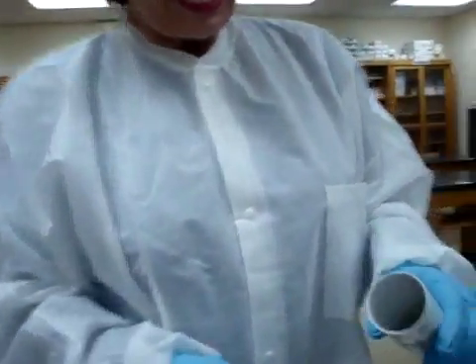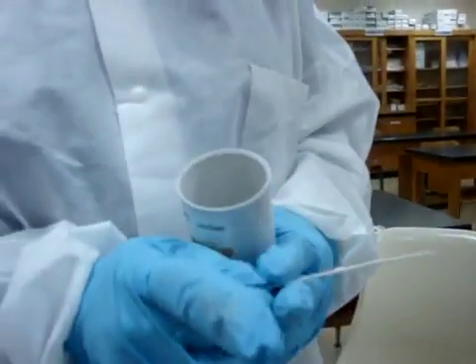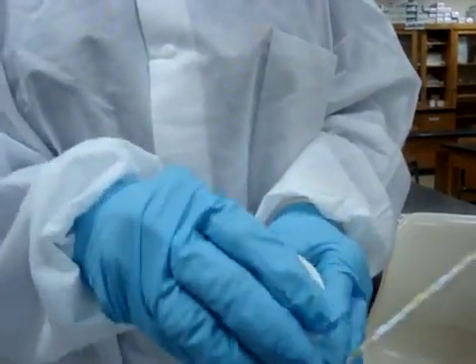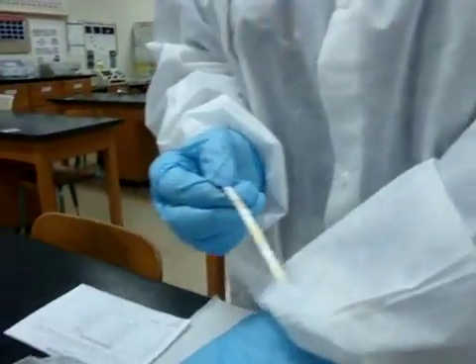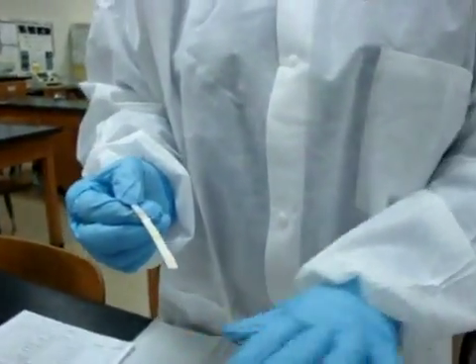When we use a dipstick, we want to open up our container, remove one dipstick at a time, and then close our container. It is very important we keep our container closed so that we don't get any moisture in there, because moisture will actually deteriorate the chemicals that are on the strips.